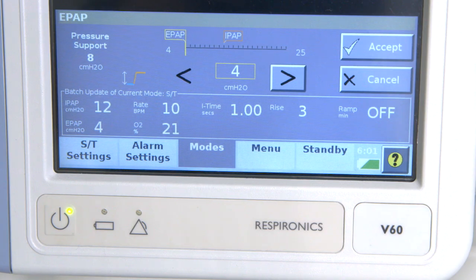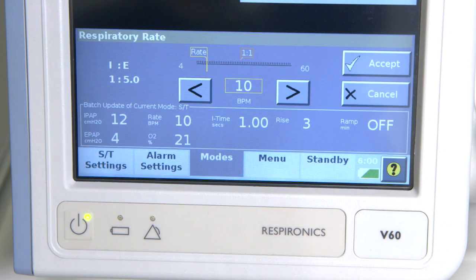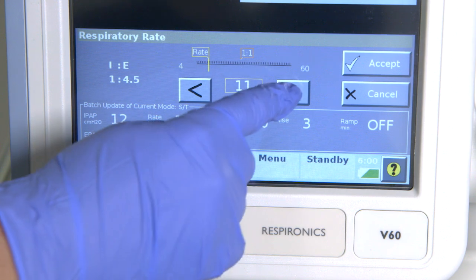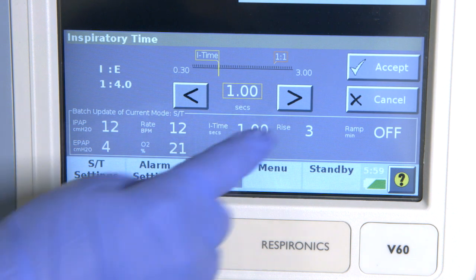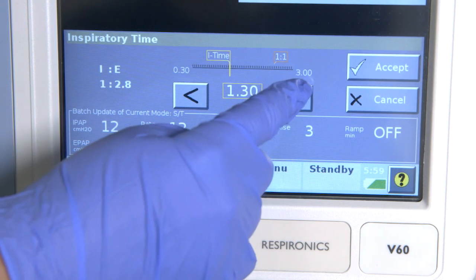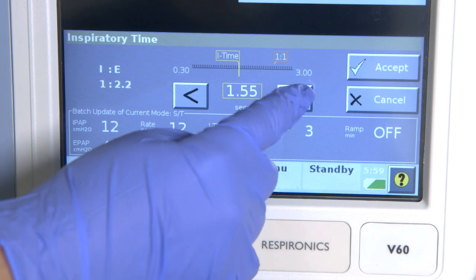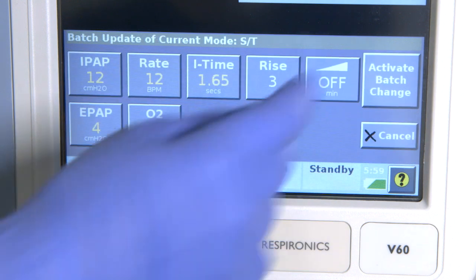Next, select the EPAP — the Expiratory Positive Airway Pressure. Generally, we set this around 4 centimetres of water. Next, select the rate, which is the backup rate: the number of breaths per minute the patient receives from the ventilator if they go apnoeic. We generally start this between 12 and 16, but once the patient is on the ventilator it may require changing. Next is the inspiratory time — the time you're allowing the patient to inspire during the cycle. Changing the inspiration time will alter the I to E ratio; we generally set a 1 to 2 ratio for patients.